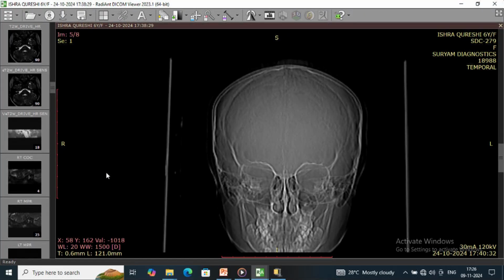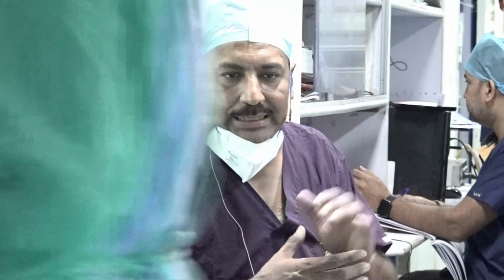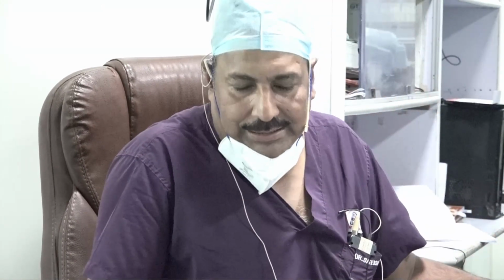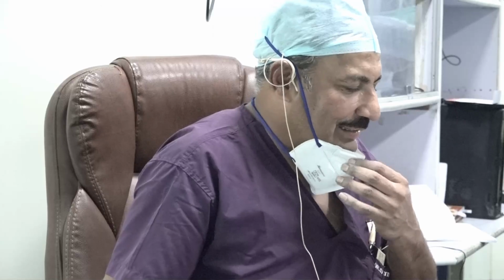So now, before we move on to the next case, any questions from the audience or any suggestions or anything anybody does differently? Because tympanoplasty is one thing which is still practiced by many people with many techniques. I know hundreds of techniques are prevalent. A lot of people are using cartilage, overlay, underlay, over-underlay, a variety of flap making, and in their hands they must be doing good results. I believe every technique gives good results. After we train with you, that becomes a standard for us to do the same technique.